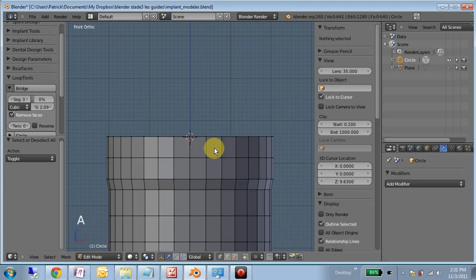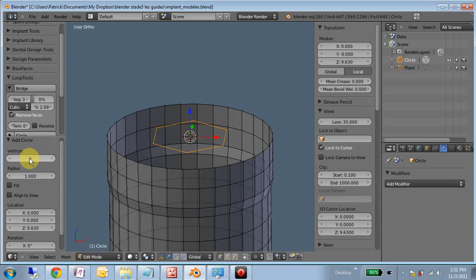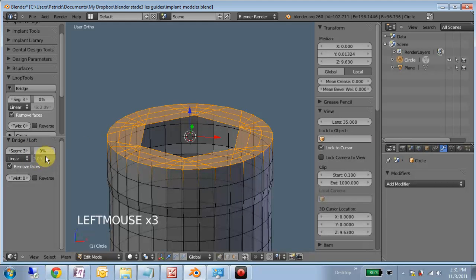So I'm going to add a circle. Now I'm going to select change in the redo panel here, 6. That establishes our hex. I just know from memory that our hex diameter is 2.7 tip to tip, which half of that is 1.35 for our radius. Hold Alt and Shift to loop select this and bridge that. We want to go linear, 0.